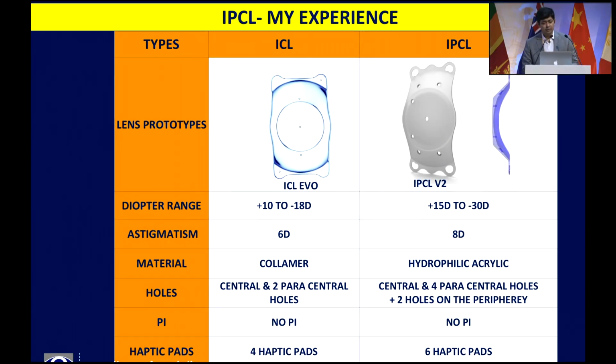So really, when we look at the IPCL and compare it to the ICL, which has really been around for more than 2 decades now, we have a very wide dioptric range in IPCL. Almost any power can be made, any spherical extent, cylinder. The wide customization that is available with IPCL is what really makes it stand out. It's a hydrophilic acrylic material, but I'm sure as the talks in the subsequent session will also show that it really doesn't make any difference.